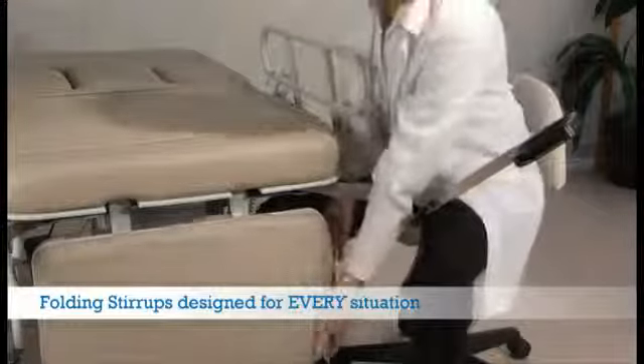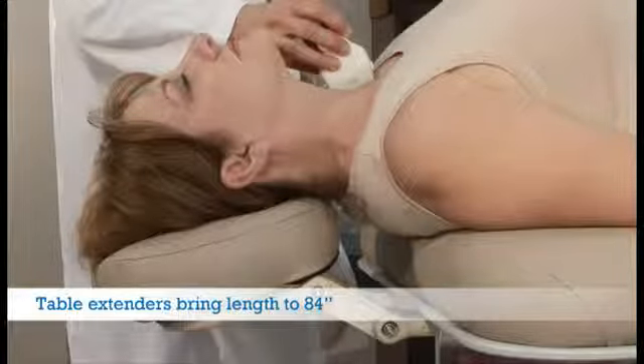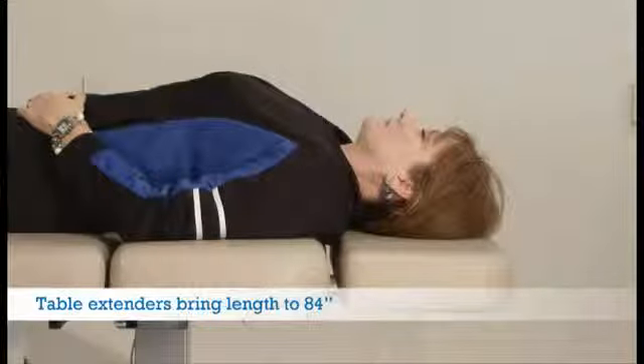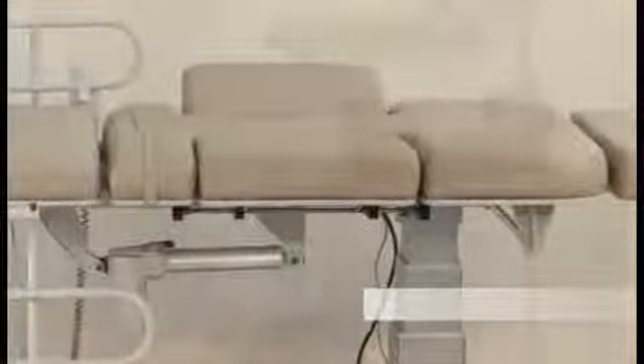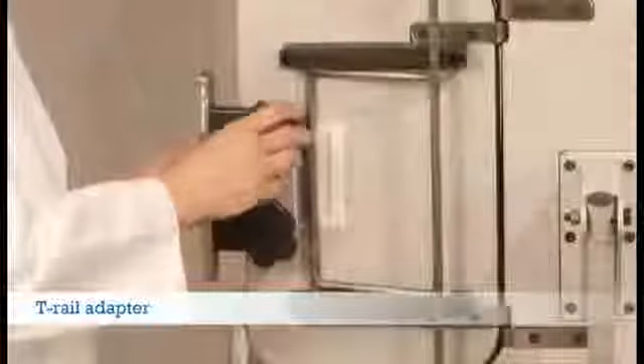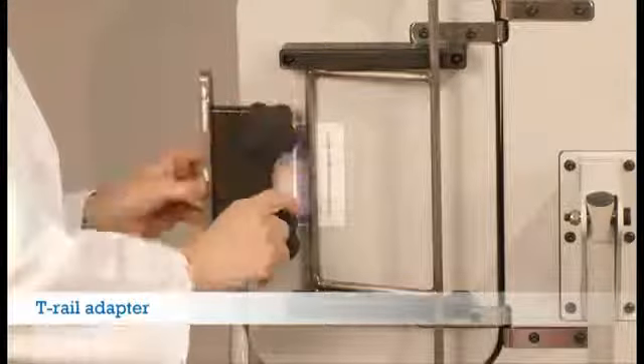Stirrups store inside out of the way and are made of stainless steel. Optional table extenders like the head support shown here allow accurate and comfortable cervical positioning. More traditional table extenders allow you to increase the length of your table to 84 inches.